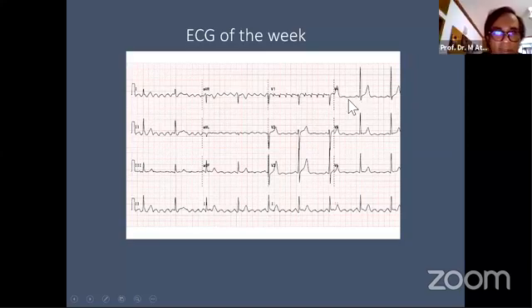যখনই তুমি V4, V5, V6 তে যাবা, you will be confused. There are some P waves. So this is in contrast. At the same time, there should not be the sinus beat and the flutter wave. So this is one of the points that rules out the possibility of atrial flutter. Again, why do some leads show the sinus beat and why do some leads show flutter-like waves? Please look at the left-sided leads, that is V4, V5, V6.